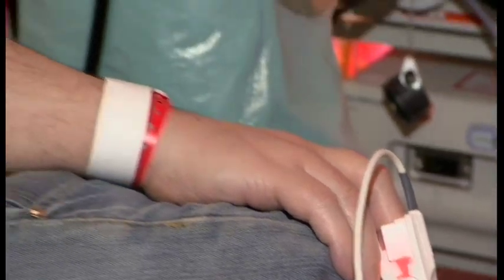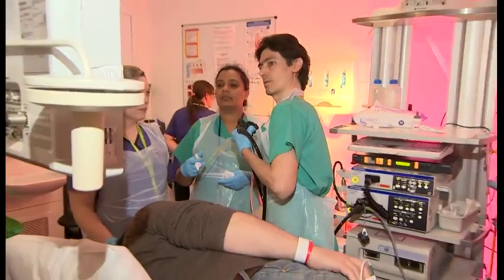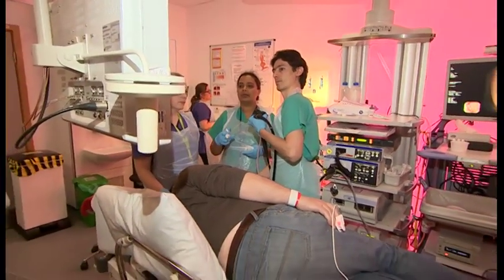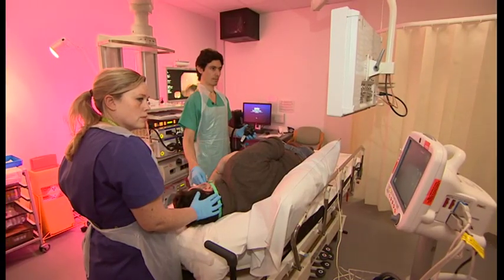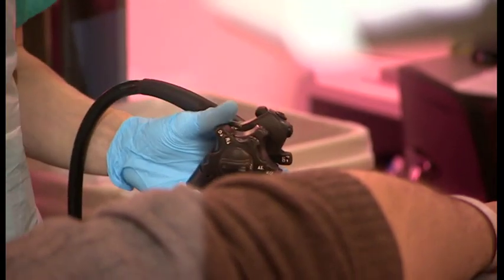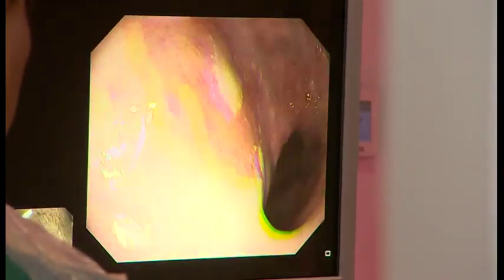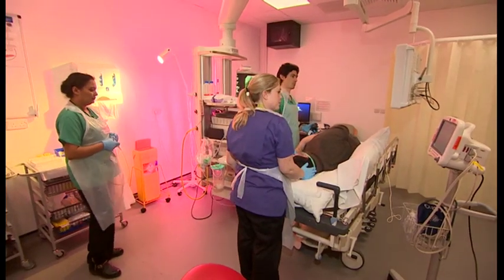Right now, this is how you find one of Britain's deadliest cancers. Close. Open. Esophageal cancer kills 21 people a day because it's so difficult to spot. Using a camera with a normal white light on the end, the doctor's looking at the dark red patch. It's a condition called Barrett's esophagus. Not dangerous in itself, but it can contain cells that turn cancerous, if you can find them.